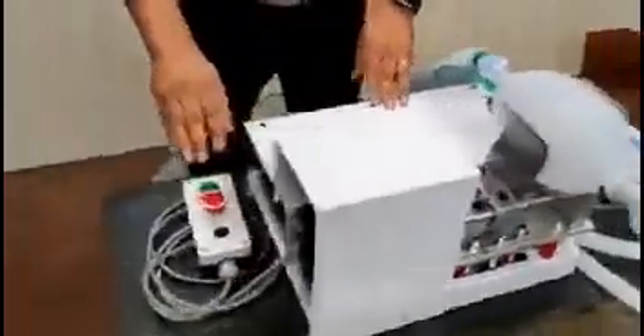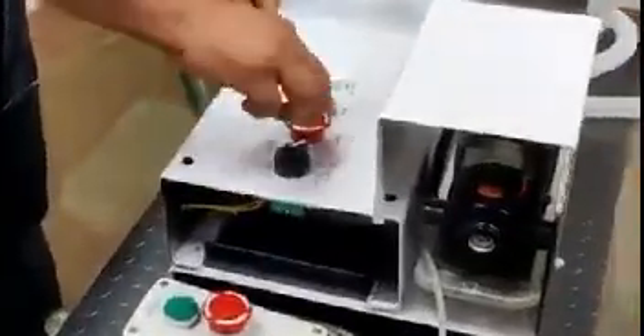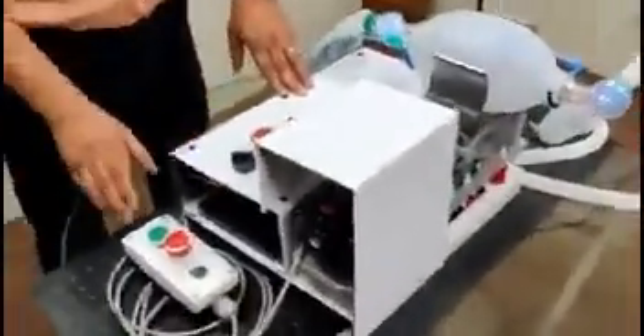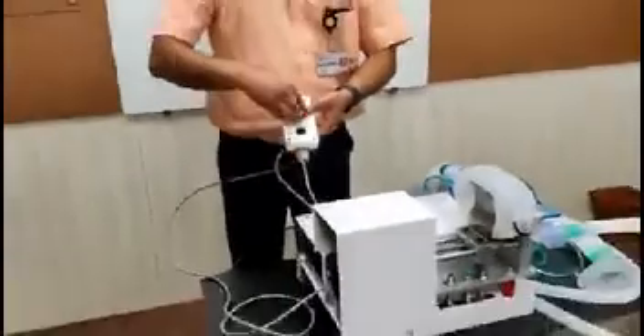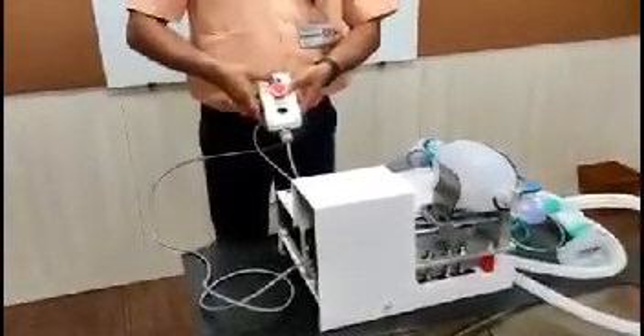We have provided an emergency stop button on the console, so in case of an emergency we can stop this device. There is an additional handle pendant device provided especially for the patient, along with a long cable. An emergency stop button is also provided on the pendant, along with a doctor's call button for the ease of the patient.